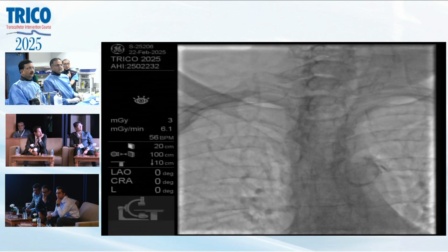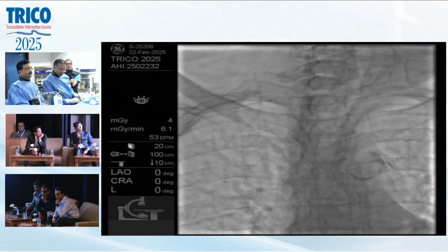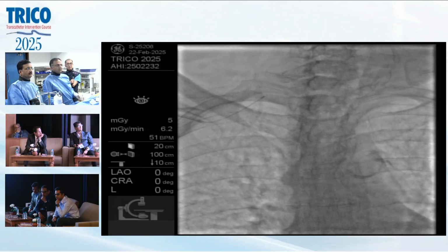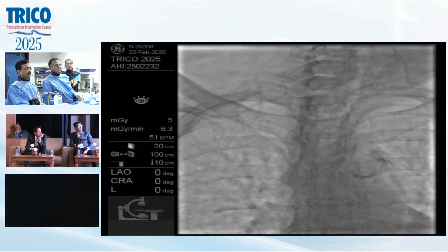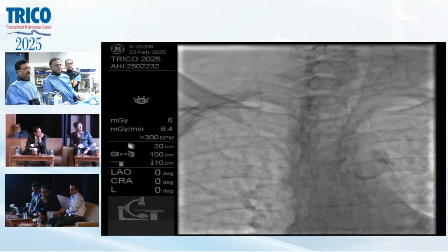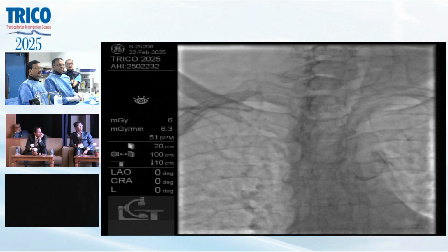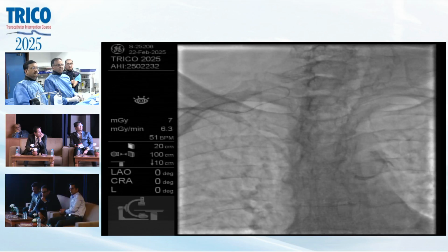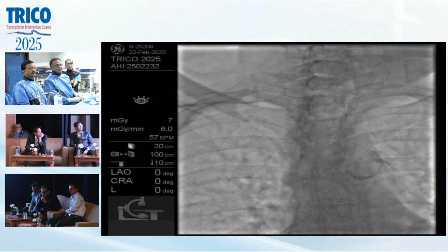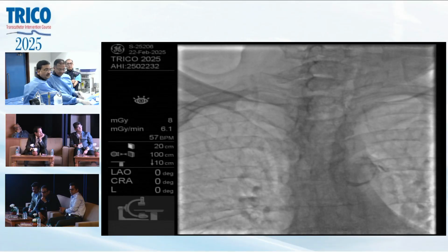That's very interesting. Anatomy. EBU lesion. A bit of tortuosity. Contrast injector. Let's bring it back. The metal wire.